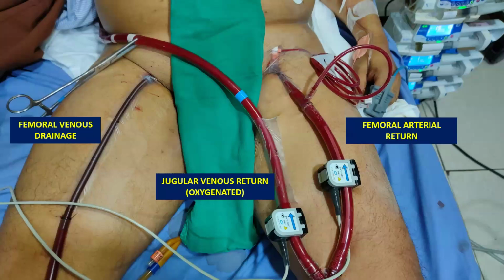This is the venous return where we are giving it in the right IJV. The right heart gets some oxygenated blood which goes to the left heart, and the left heart ejects oxygenated blood too. So this is how we can treat the Harlequin syndrome.